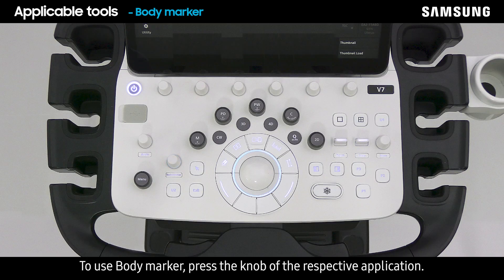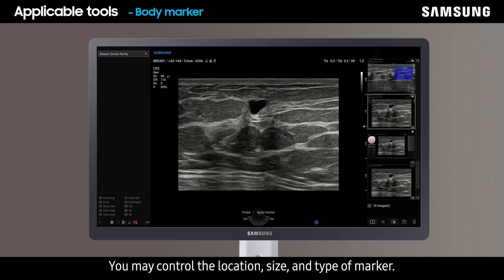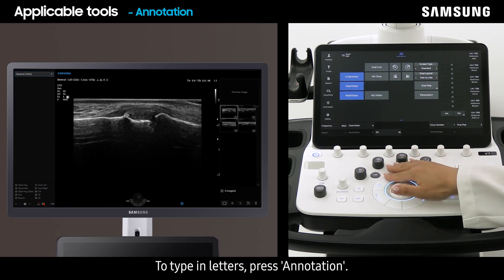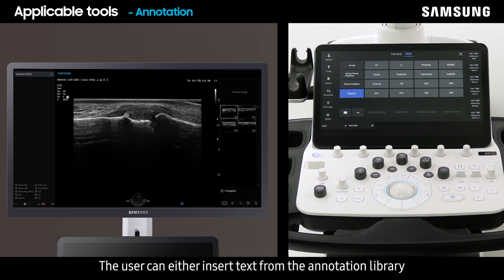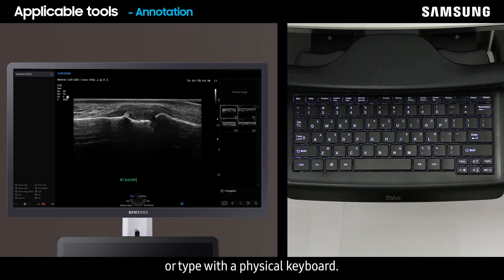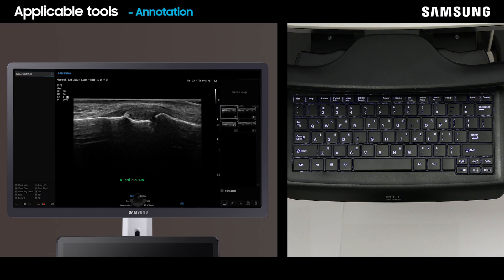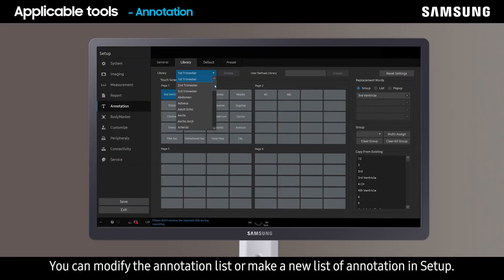To use body marker, press the knob of the respective application. You may control the location, size, and type of marker. To type in letters, press annotation. The user can either insert text from the annotation library or type with a physical keyboard. Press erase to erase the text. You can modify the annotation list or make a new list of annotations in Setup.